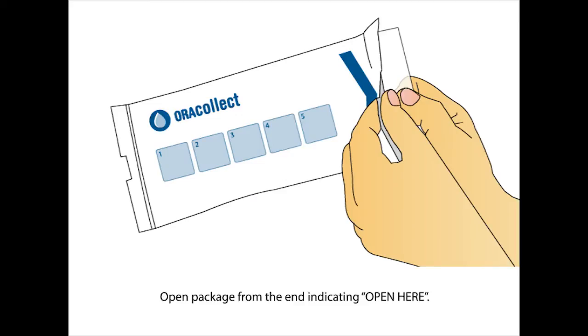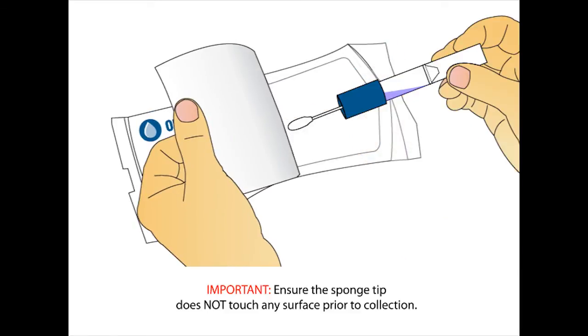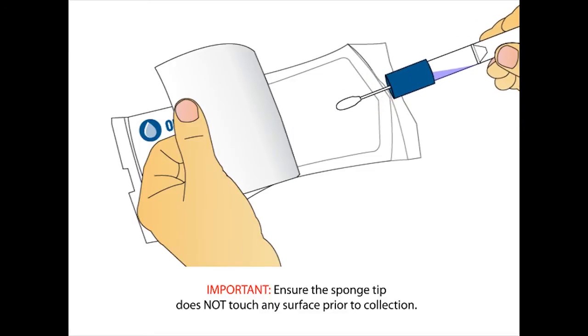Open the package from the end with the 'open here' arrow. Remove the collector by its handle from the packaging. Ensure the sponge tip does not come into contact with any surface prior to collection.